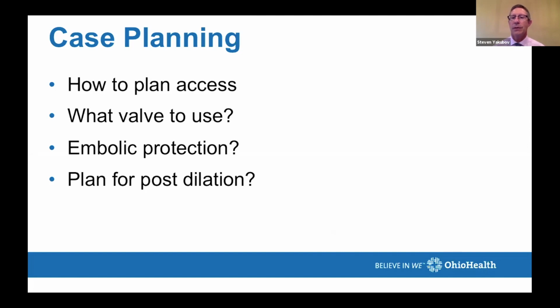Who would use embolic protection on valve-in-valve? I don't think we touched on that. I would. Sorry, no, go ahead, Sushil. No, I would. I think these leaflets are so degenerated, so abnormal, and the risks are high. But I'm a big believer. I use it fairly routinely in all of my cases, so I have a low threshold.